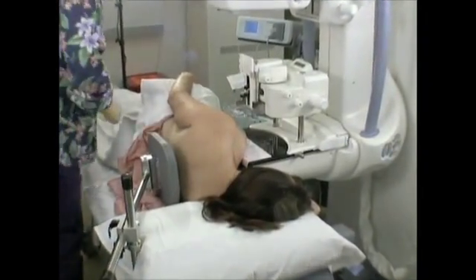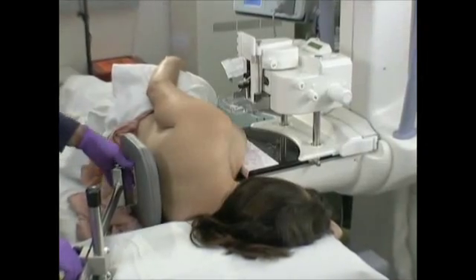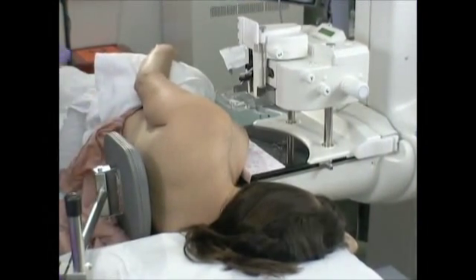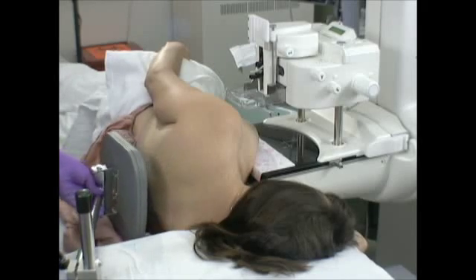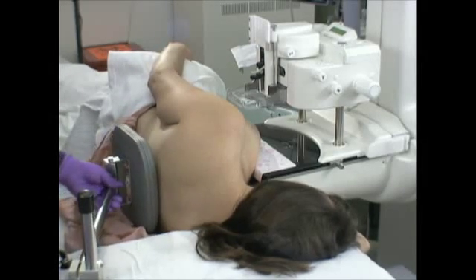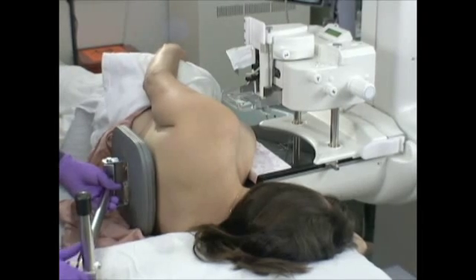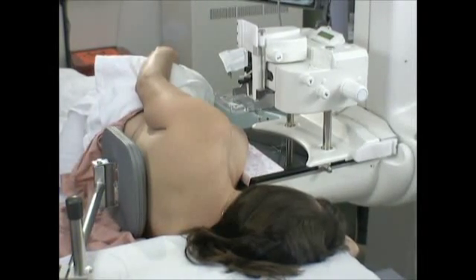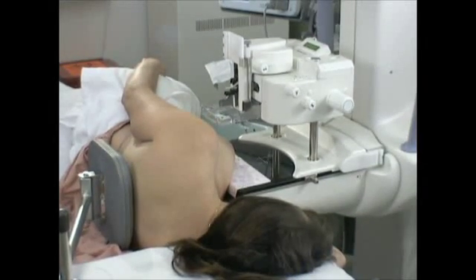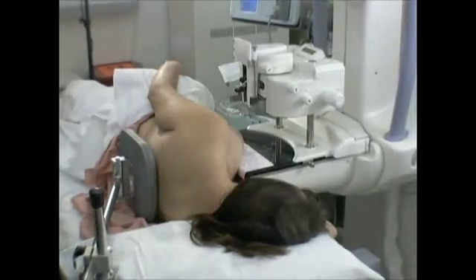With the Medical Positioning's DBI table, the patient is able to lay comfortably on her side. The table snugs up to the mammogram machine and we're able to offer the patient back support so that she's extremely comfortable. This is compared to prone positioning on a dedicated table, which is not nearly as comfortable for the patient.